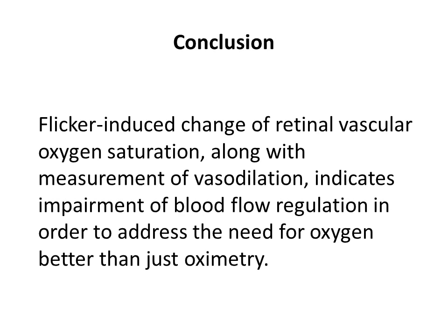So, in conclusion, we might state that flicker-induced change of the retinal vascular oxygen saturation, along with the measurement of the vasodilation, indicates impairment of blood flow regulation in order to address the needs of oxygen better than just oximetry. Or to sum it up in a very simple take-home message: oximetry is good, combination with flicker is better.